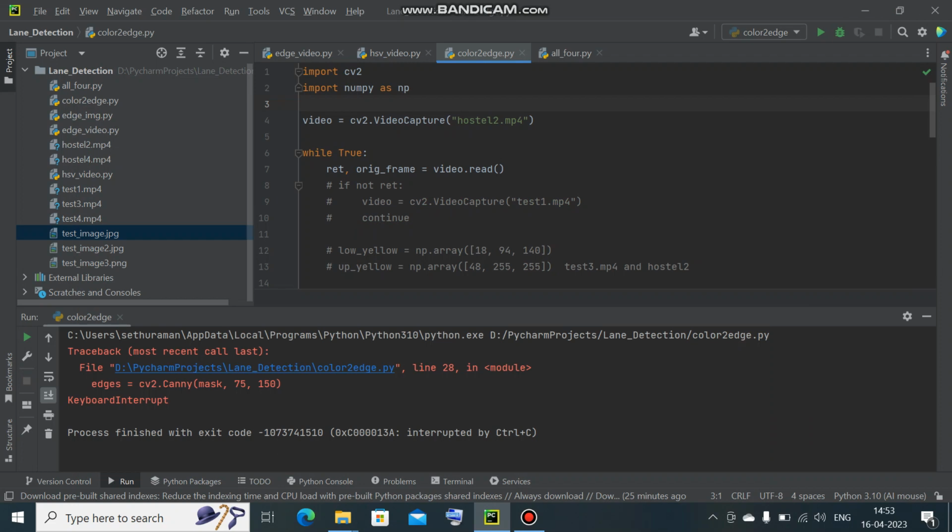How are we going to do the CNN? Using a remote car, we will fix a PiCam and run the remote car on our track. Then we will convert our video into frames and train a convolutional neural network. Using the convolutional neural network, we will train a model. Then using that model, our wheelchair is going to move. After that, we will combine this image manipulation algorithm and the CNN algorithm together and see the result. The simulation part is also added next to this.